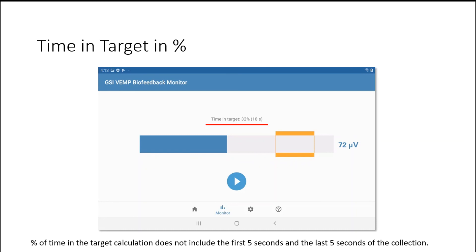The percent of time does not include the first five seconds and the last five seconds, so if you're practicing and it seems like you've been doing the task for a while, keep that in mind — it gives you time to re-instruct the patient before and after the test. The time in target is not saved on the tablet, so if you want to report or track it, you need to record that with paper and pencil.